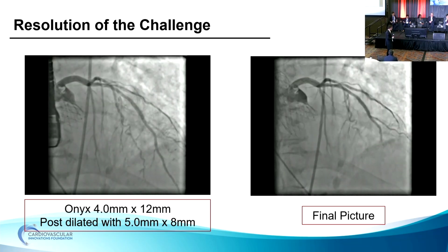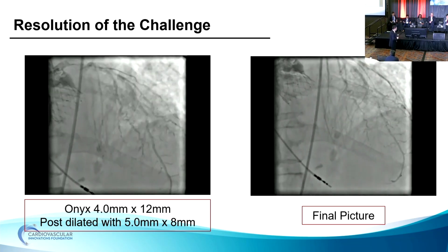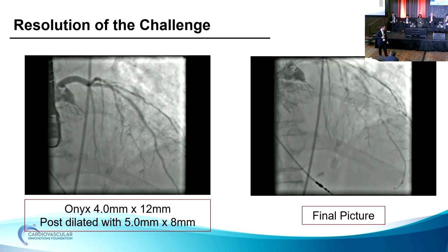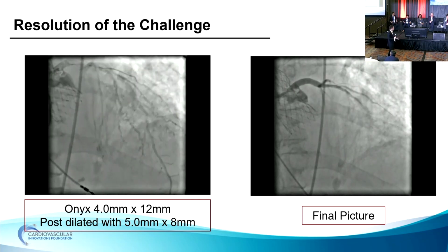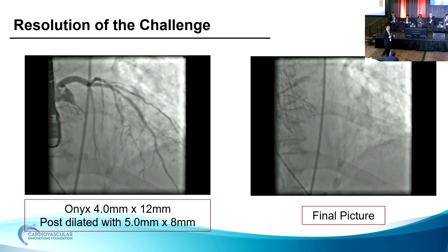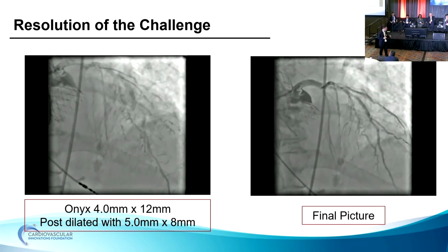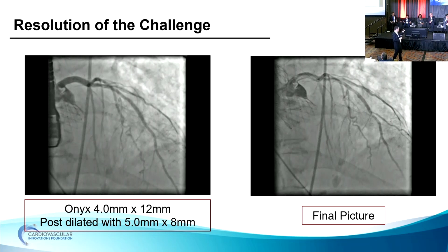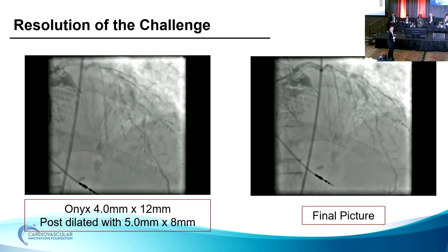But it's not a big chimney going all the way back? No, we didn't do a chimney, exactly. So it's only a few millimeters. We're not worried that we occluded the valve with a native leaflet, just extending all the way up. Whatever closed the vessel, we want to make sure that we have enough radial force to not allow it to just shift back upwards.